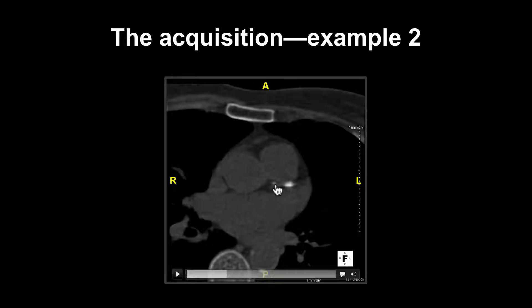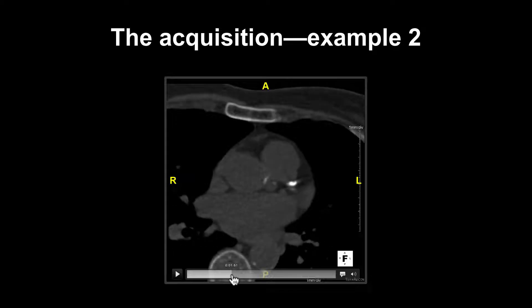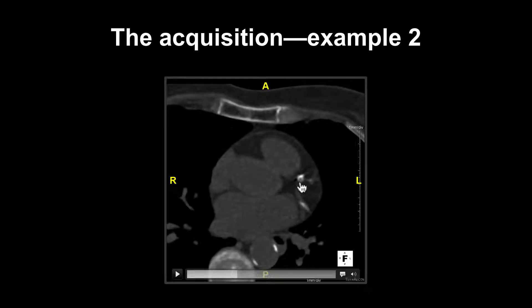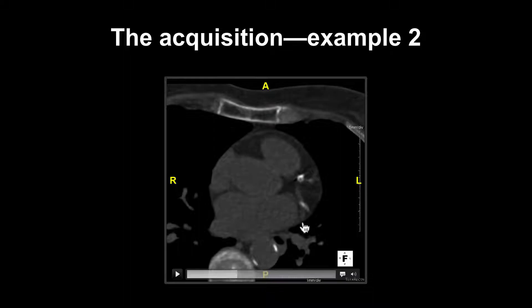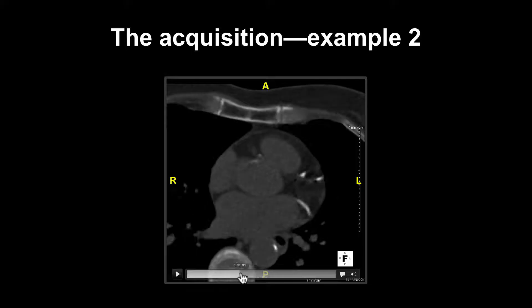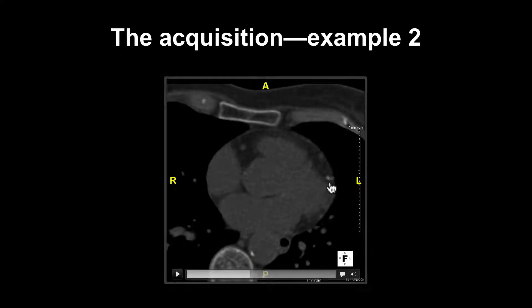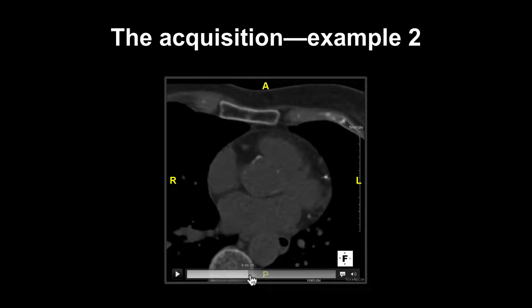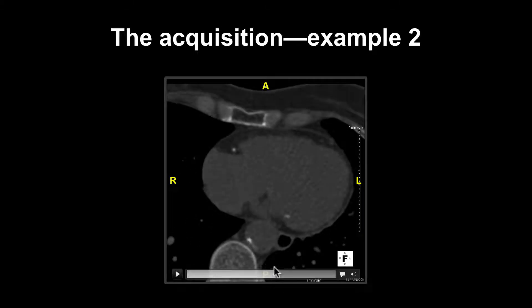Here we can see the calcification in the left main stem and also the proximal LAD segment. As we scroll down through the imaging set, we can see further coronary artery calcium in the proximal to mid LAD segment and also within the left circumflex artery. If we scroll down further, we can see calcification in the first diagonal branch and also within the mid-segment of the right coronary artery.